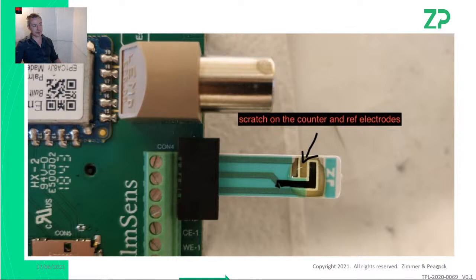The reason I bring that up is, if you're using connectors, any kind of connectors, you just have to make sure that you're lined up well with a connector. So here, I know that this particular connector is known to me. We didn't supply it, but it's known to me. It's essentially got the conducting or the contact points along here. So in this electrode, they're all lined up pretty well.